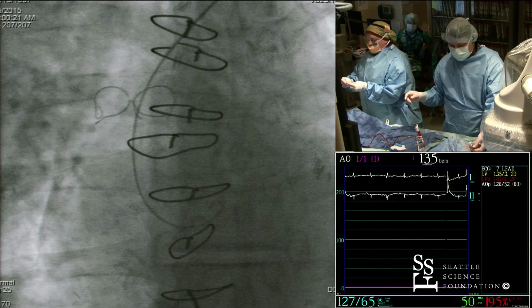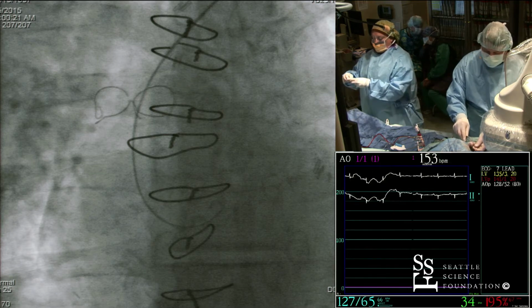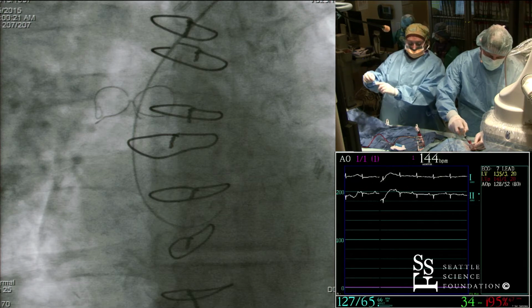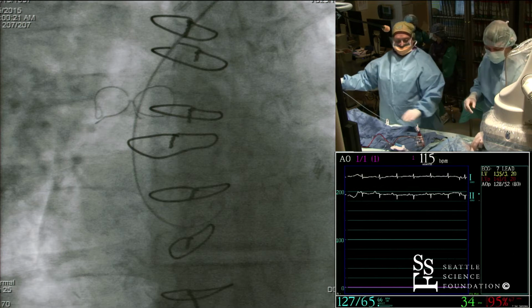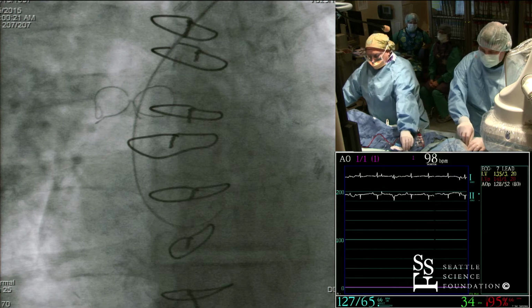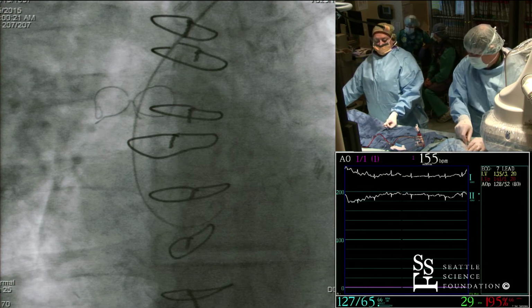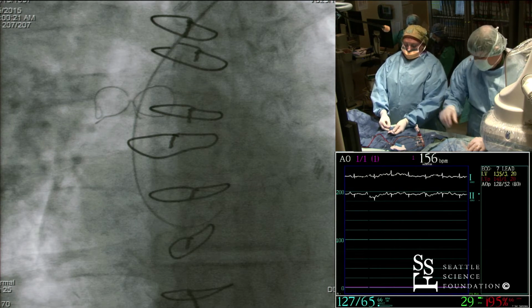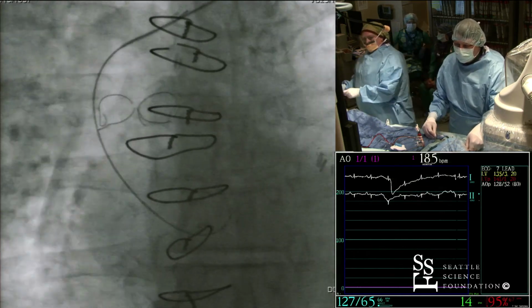That flush, please. So Mauricio, are you still flushing your sheaths after every exchange? No. Okay, I've still got the images of Vic Behar yelling at me. Mauricio and I trained in the same program. Well, the patient is fully anticoagulated. Luckily, in a significant number of cases, I wouldn't say the majority, but 50, 60% of the cases, we just do everything with only one catheter.